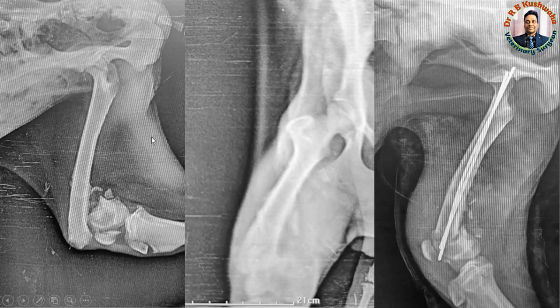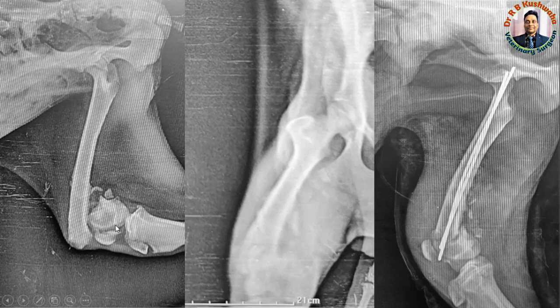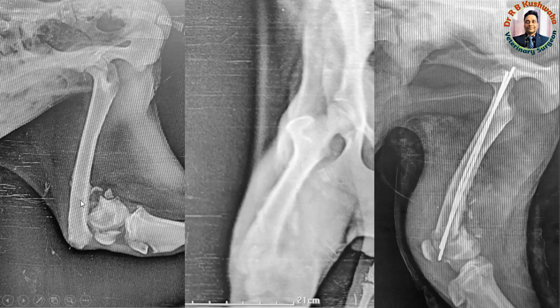This is the second case — the medial-lateral radiograph of a stray, non-descript dog that presented 10 days after the trauma. This is almost a physeal type of fracture, very close to the condyles. The proximal fracture fragment is very close to the skin and the distal segment is very small. This type of fracture is very difficult to manage with a single intramedullary pin or other techniques.